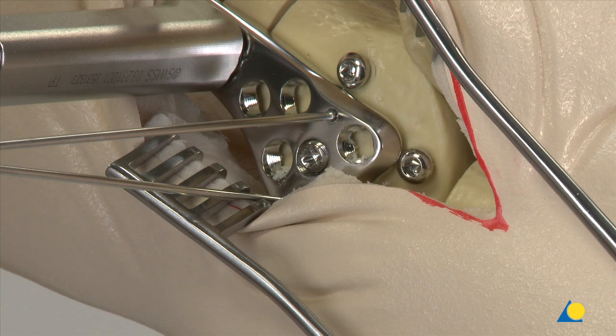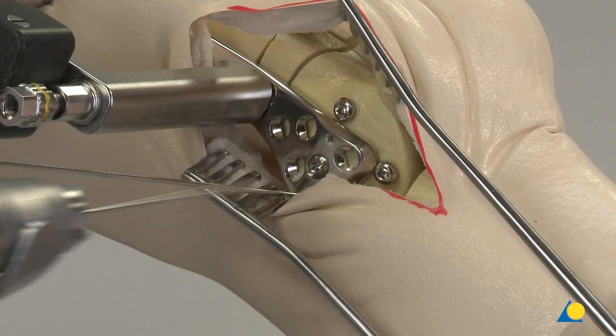If the screw is not parallel, then a malreduction will persist. In this scenario, the surgeon must return to the fracture reduction and repeat the process. Remove the K-wires.